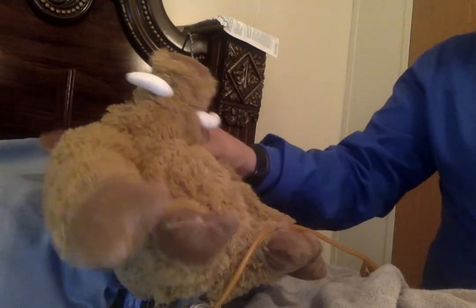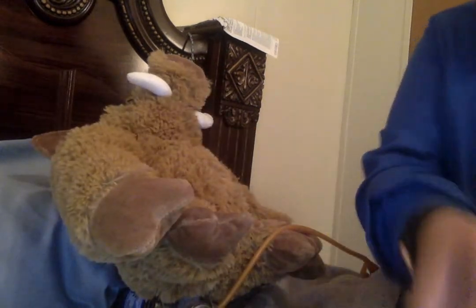I'm going to explain the procedure to the patient. So today we're going to take out your catheter. Do you agree to that? Yes, that would be great. Okay. So, we are going to raise the bed to a comfortable working position. And we did. And then we are going to apply our gloves.